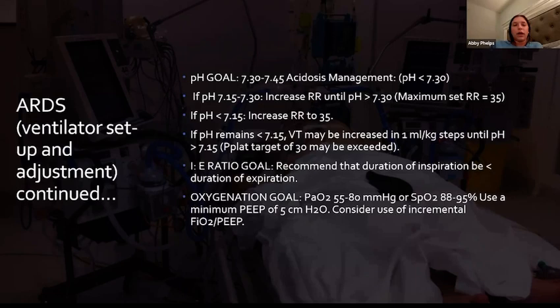And for your I to E ratio, you want your inspiration to be less than the duration of expiration.